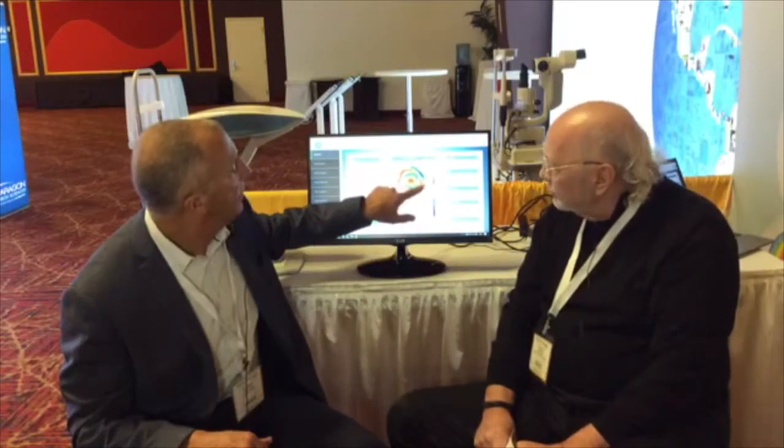So how about if there needs to be a notch in a lens or something? What does this show us related to that? Notches we've done in the past. Sometimes they work, sometimes they don't, and the biggest problem is they're never reproducible. Now we can see, this is a good example, a patient with a large pinguecula. And whether it's a pinguecula, or maybe there's a shunt or a bleb, and you have an elevation that's not normally there, we can address that.